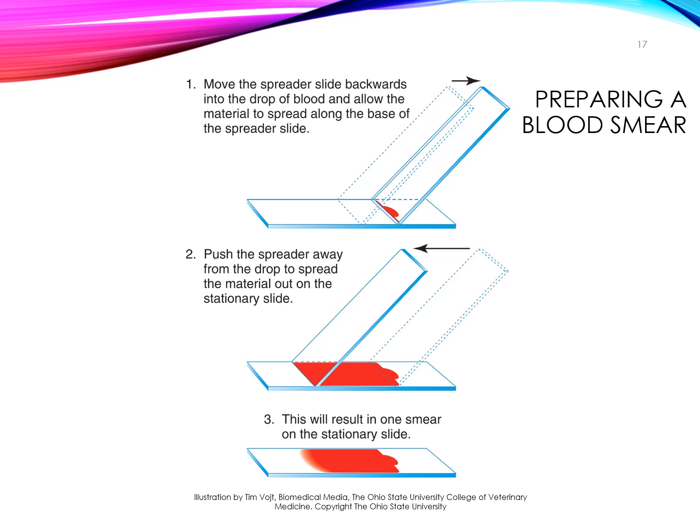Making a blood smear is a very important part of a CBC, as certain things can only be seen in the blood smear and not evaluated by a machine. Certain things like cell morphology and cell abnormalities. So it is important to be able to make a blood smear in any lab or hospital where we're running CBCs.